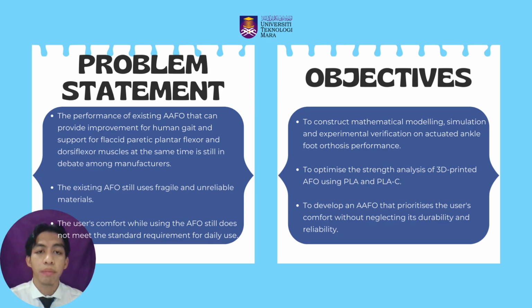The first problem statement for this research is that the performance of existing actuated ankle foot orthosis that can provide improvement for human gait and support for flaccid paretic plantar flexor and dorsiflexor muscles at the same time is still in debate among manufacturers. Second, the existing ankle foot orthosis still uses fragile and unreliable materials. And the third is the user's comfort while using the ankle foot orthosis still does not meet the standard requirement for daily use.